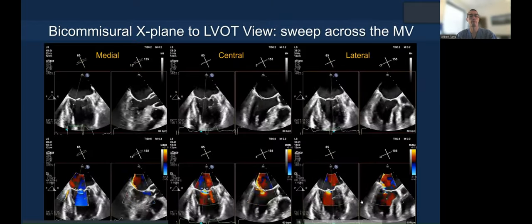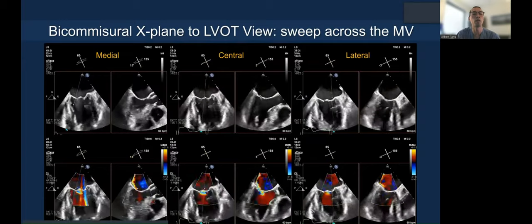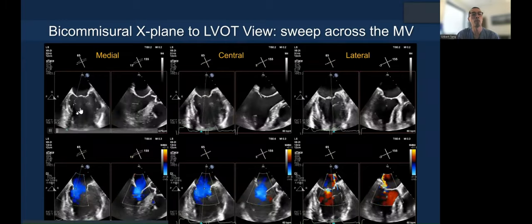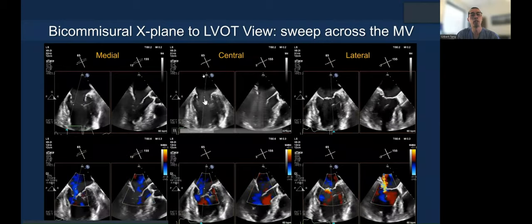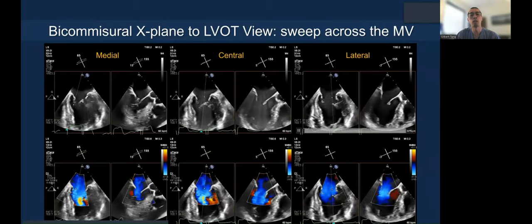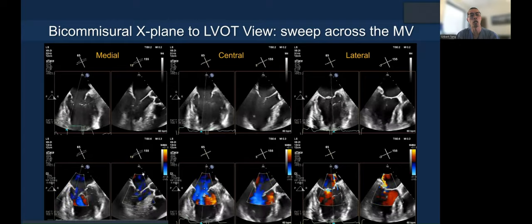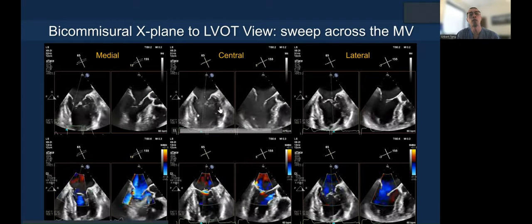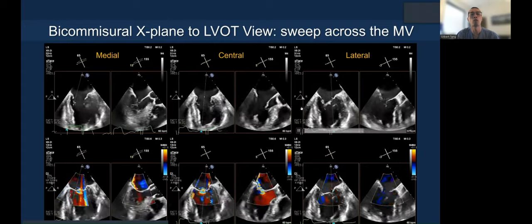You then perform a sweep. You can see the medial side on the left where the cursor is located on the medial aspect of the valve, then sweep to the middle, and then sweep lateral — both with and without color. Color tells you where the jet location is and the width of the jet; without color shows you the actual pathology where you're trying to grasp.